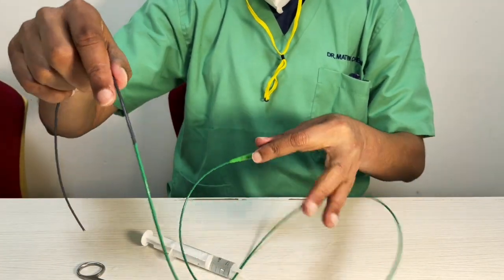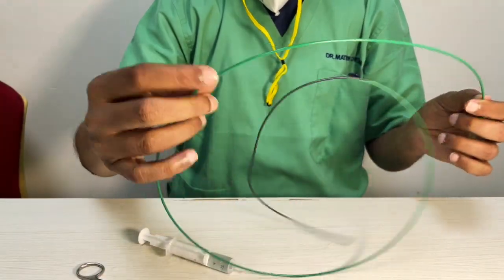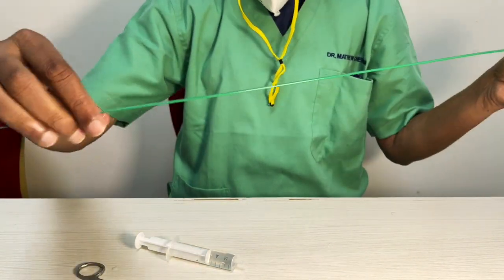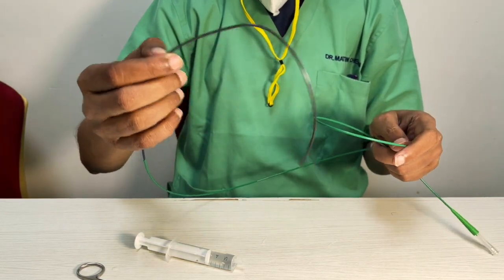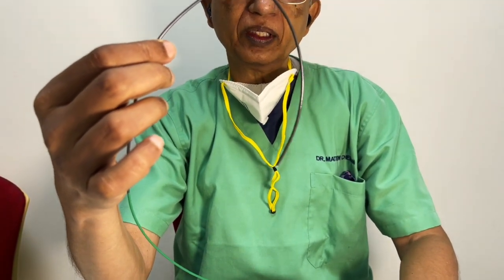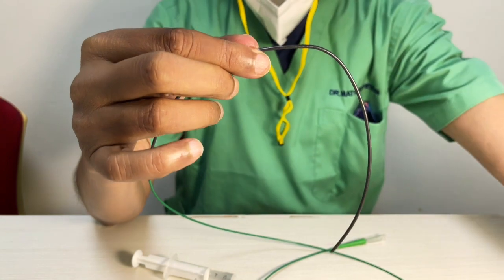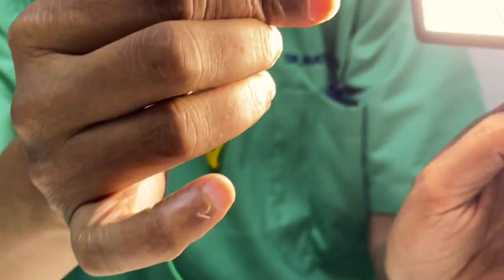This is a catheter which even in a hold you find seems to be a lot more springy. So how did they get this effect, which seems to be a lot more pushable? See, when you hold it, you feel it practically leaping in your hand. And look at it, the distal is super floppy, much more floppy than anything else. So what these people did, now I want you to look at this. I'm going to bring the light on the other side. I hope you can see it. I want you to have a look. Can you see the braiding here?